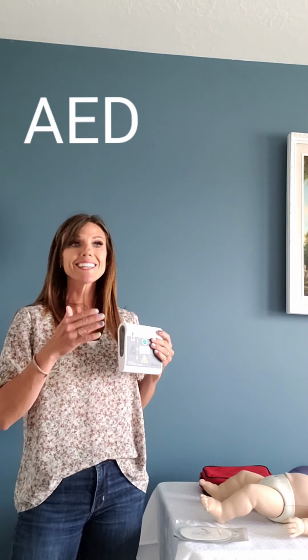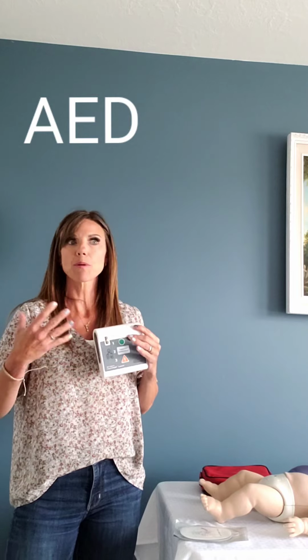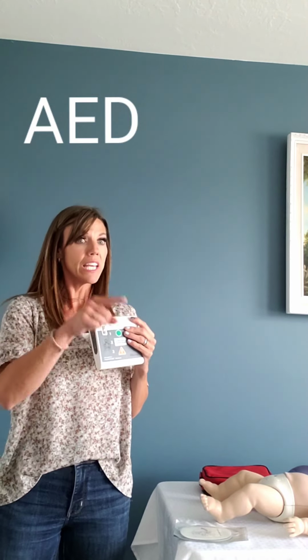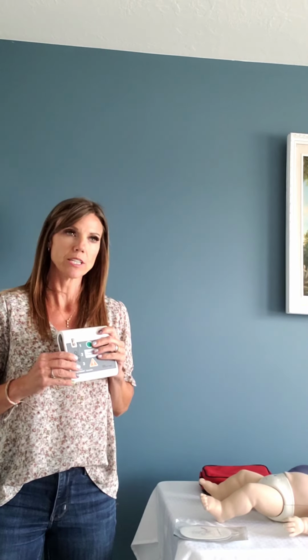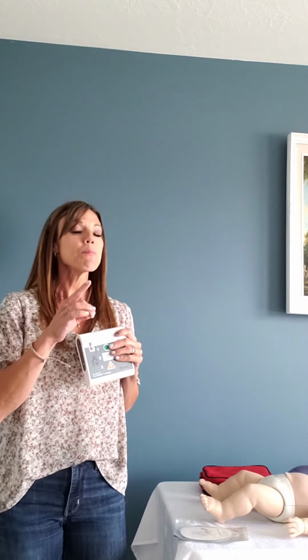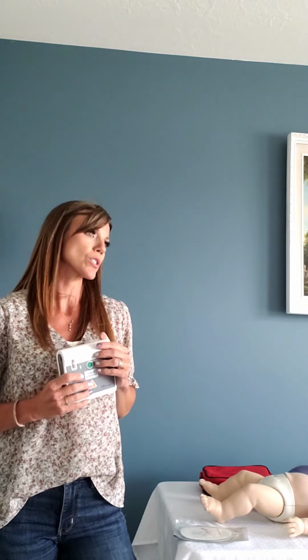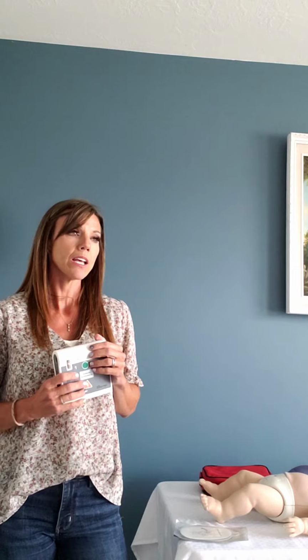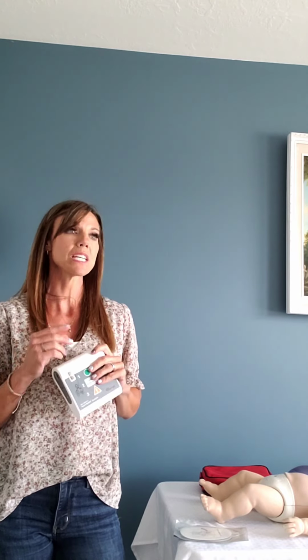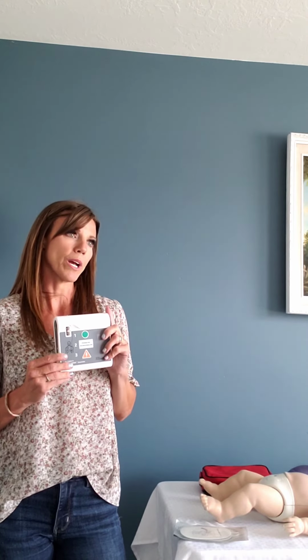So if you're ever taking care of a patient, or if you're ever in a room and someone passes out, you see them on the monitor, if you see that rhythm, that is ventricular fibrillation. That's usually the first dead rhythm that someone has. That sounds kind of weird. But when somebody's heart first stops, it's not like in the movies where it's going along, then it flatlines. It usually goes to that ventricular fibrillation. That rhythm is the best rhythm to bring somebody back when they're in that, if we can shock them quickly.